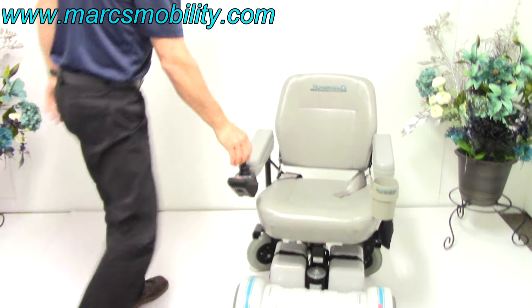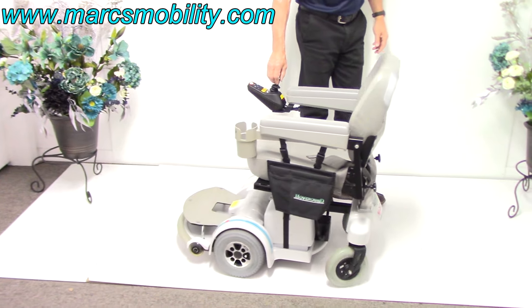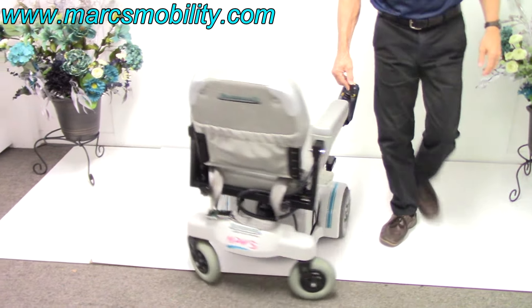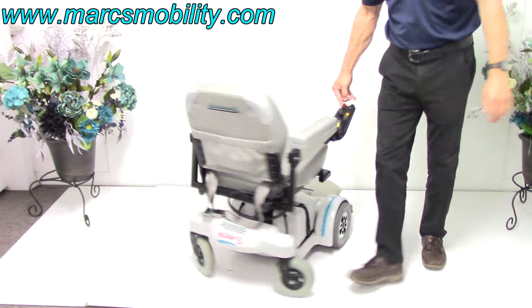This is your turning radius. So if you have it in your house and you want to see how good it turns, let me bring it over here and I'm going to turn it in a circle. This is your turning radius.